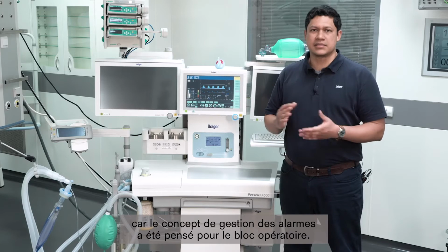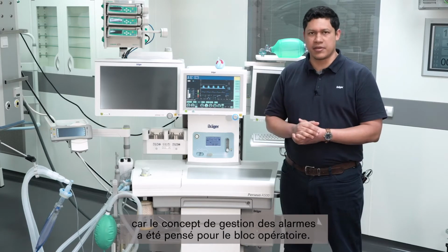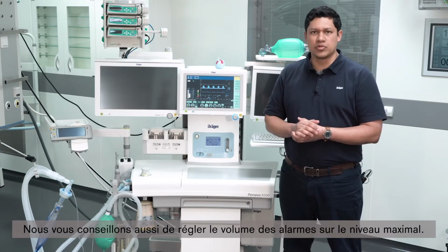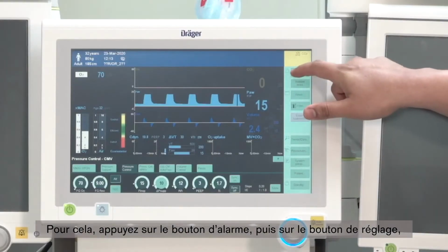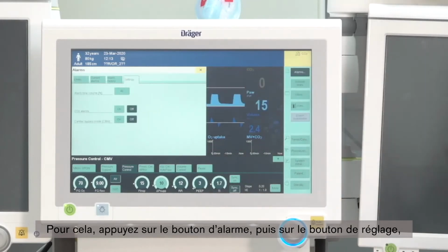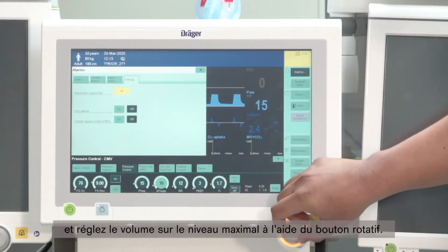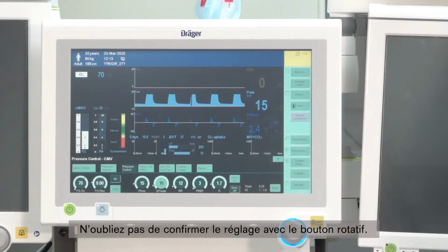Keep in mind that the design of the alarm management has been done so for the operating theater. We recommend also to set the alarm volume to the maximum level. To do so, you press the alarm button, then go to the settings, and you increase the volume to the maximum using the rotary knob. Don't forget to confirm using the rotary knob.